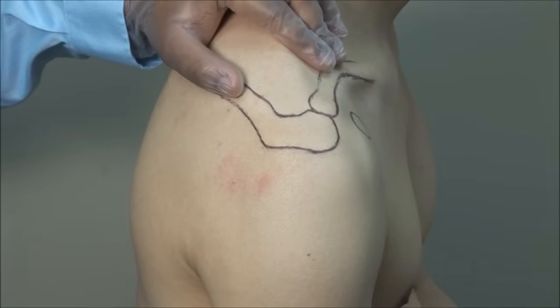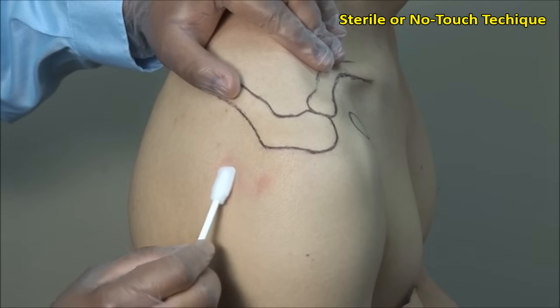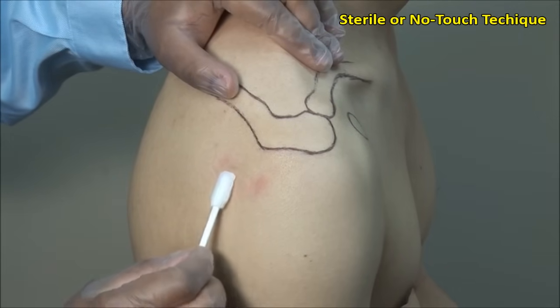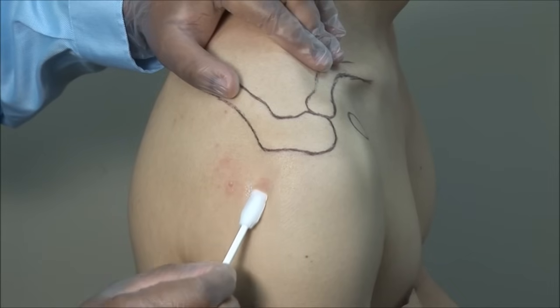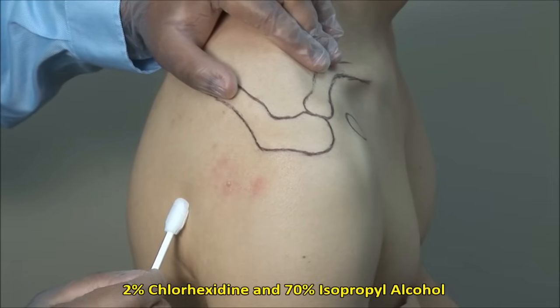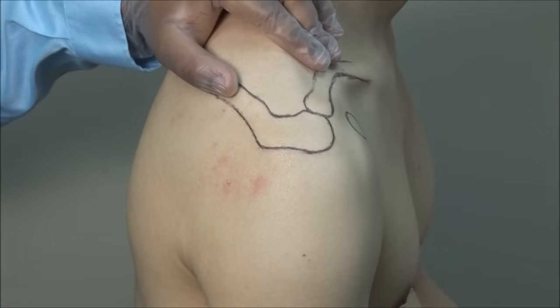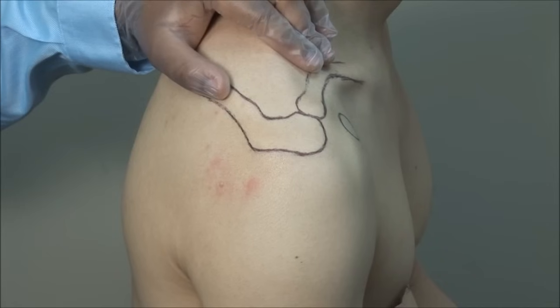These injections should always be done using sterile technique. Scrub the injection site and then clean in an outward fashion. Here I am using a mixture of 2% chlorhexidine and 70% isopropyl alcohol. Alternatively, you can also use povidone-iodine solution followed by alcohol.